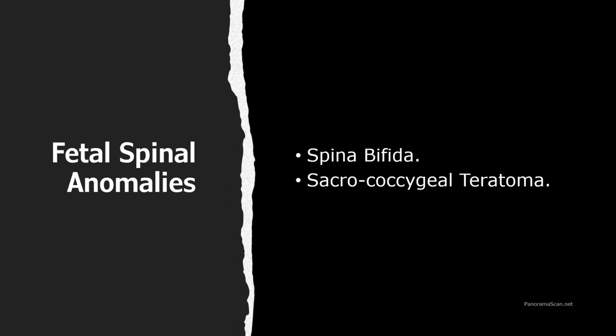Section on fetal spinal anomalies focuses on spina bifida and sacrococcygeal teratoma. These conditions can have significant implications for fetal development and are often identified through prenatal ultrasound imaging.